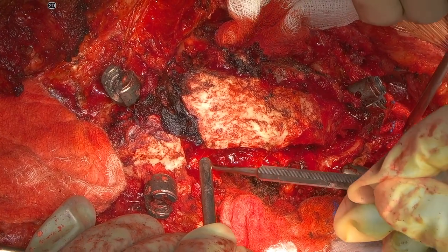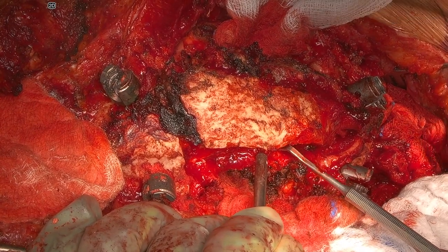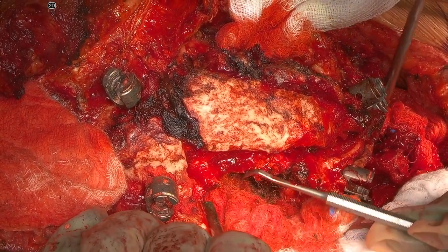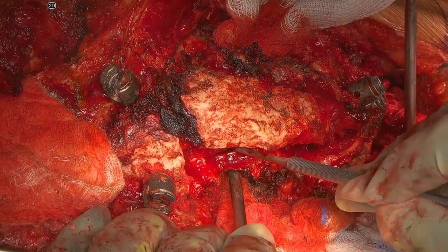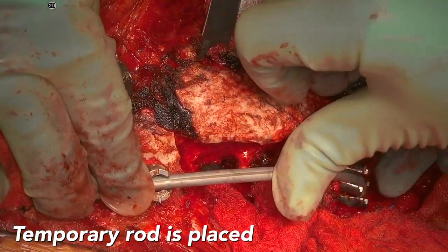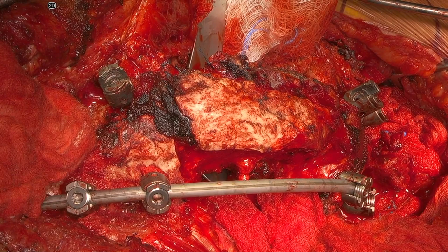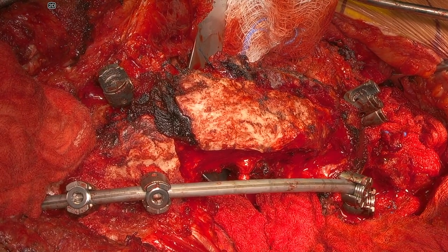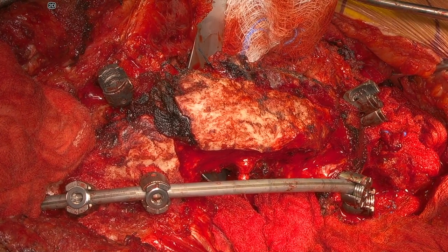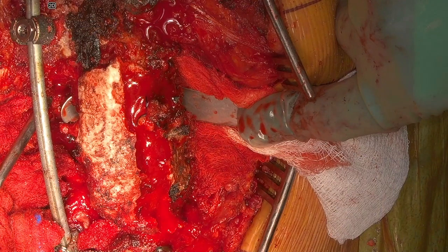Bipolar cautery and electrocautery are used to maintain hemostasis. The Woodson Elevator now displays how the canal has been entered and the dorsal lamina is completely free from both sides of the vertebral bodies, and vertebral body resection can be started. Before resecting the anterior vertebral bodies, a temporary rod is placed to stabilize the construct so no sudden movement can produce neurologic injury. Ribbon retractors and gauze sponges are used anterior to the spine to protect the soft tissues.